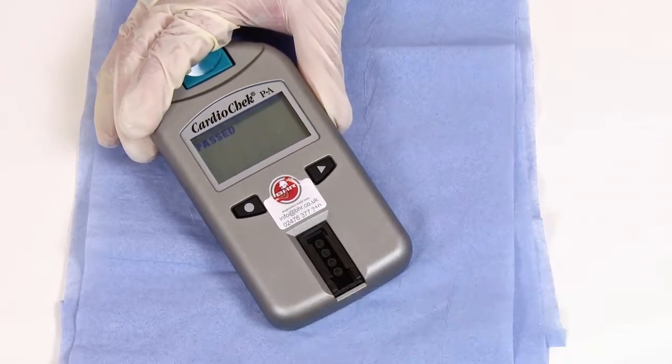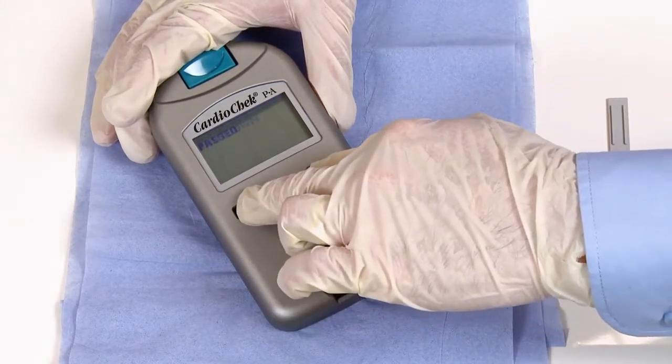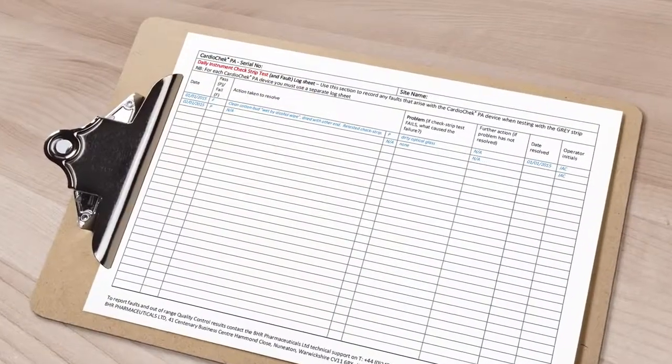Remove the check strip from the analyzer, then turn the analyzer off by holding both buttons down for three to four seconds. Don't forget to record the results on your log sheet.